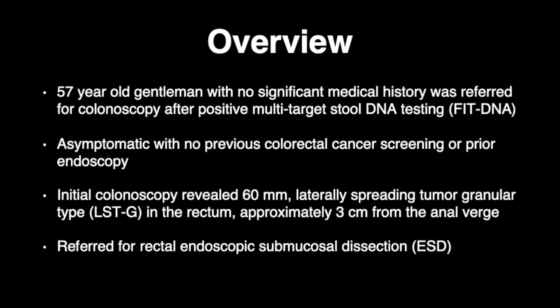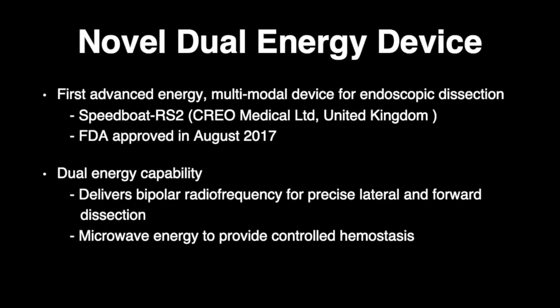Given the size, location, and non-invasive pattern of the lesion, the decision was made to perform endoscopic submucosal tunneling dissection with a novel bipolar radiofrequency and microwave-powered device. To review the Speedboat RS2 device, this novel instrument is the first advanced-energy multimodal device designed for endoscopic dissection.